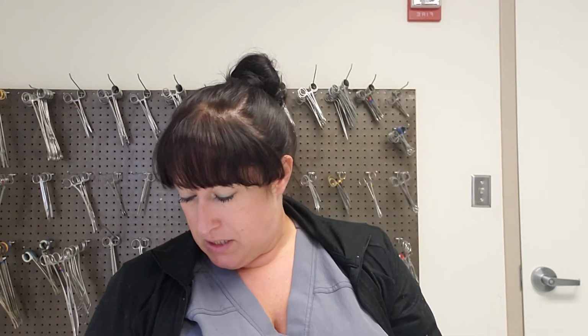There are so many scissors out there. There really are. Scissors have to be sharpened. There is a special person out there that is specially trained to sharpen surgical instruments. Scissors aren't the only thing that need to be sharpened, but as you know, even with your scissors at home, they get dull, right? Well, we can sharpen our scissors here. Well, not here, but there's somebody who comes and sharpens anything that we need sharpened. So that's great.